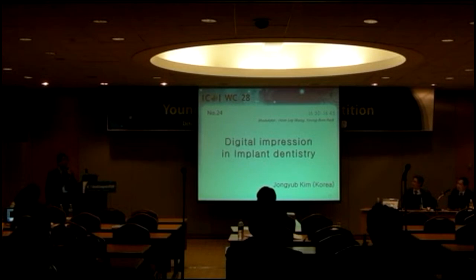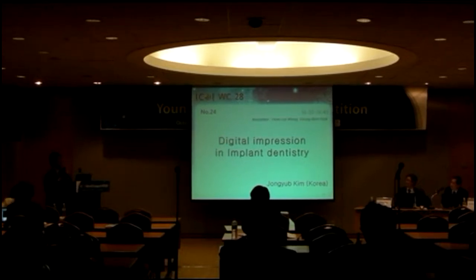Some systems use a powder that may prevent the reflection, but this iTero system does not suggest using powder because it has confocal laser technology. It looks like laser works better than LED, in my thinking. And I'm not the only one who came up with this kind of laser result on natural dentition.